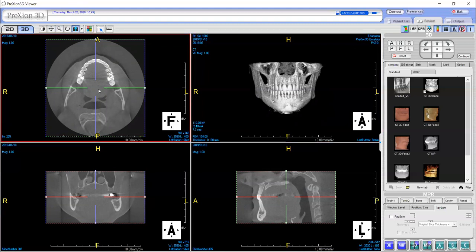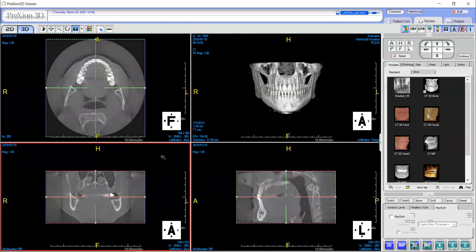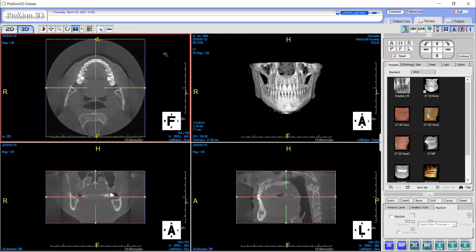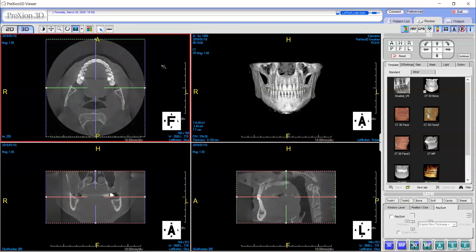Let me show you what I mean. I'm going to hover over my axial view and hold down both the right and left click of the mouse simultaneously. You'll notice my cursor changes to 'WL,' letting me know my window level function is now activated. Now I'm going to move my mouse up and down to adjust the contrast on my CT images. Note that my CT images work together — if I adjust the window level in my axial plane, it adjusts in all planes. You can do this over any of your CT images: hold down both the right and left click and move your entire mouse up and down to adjust the contrast.